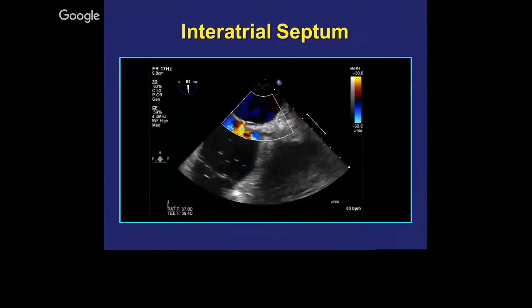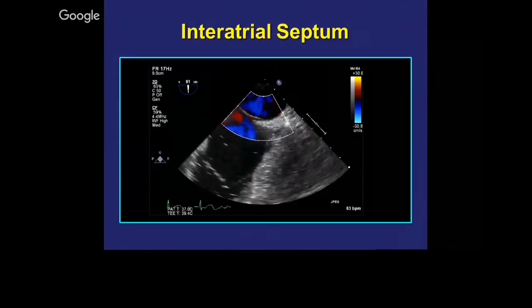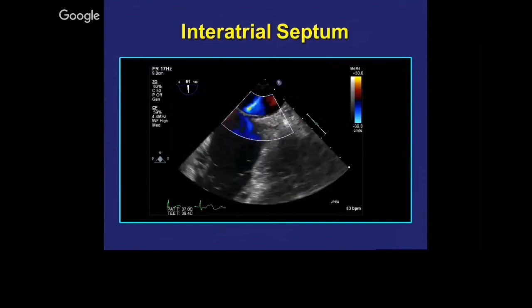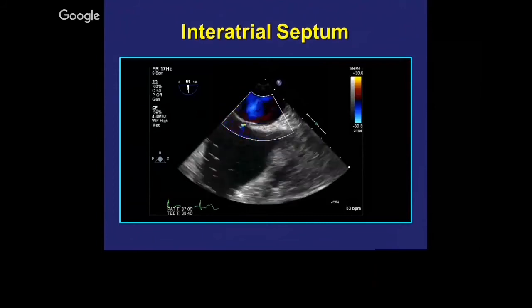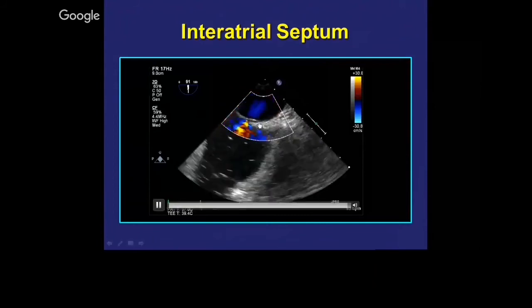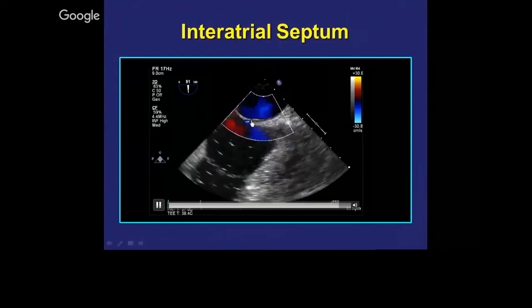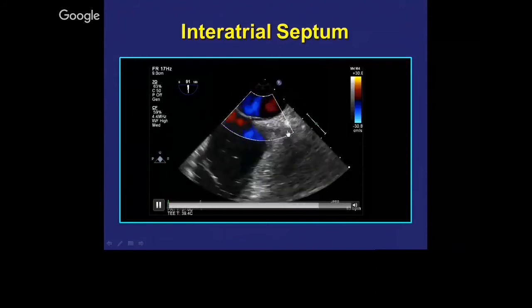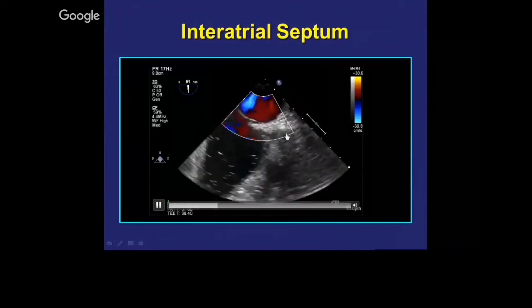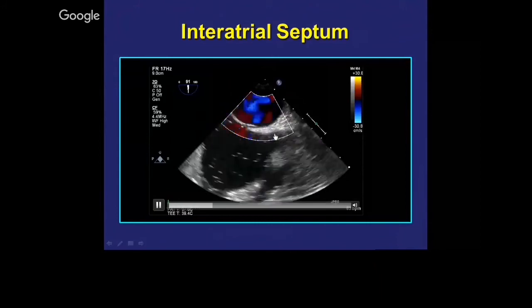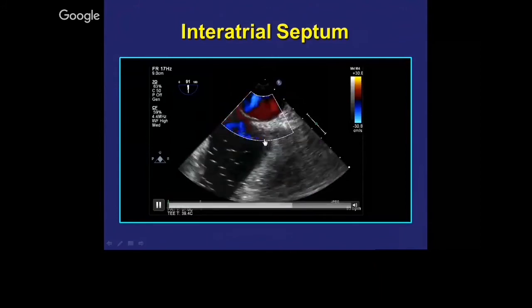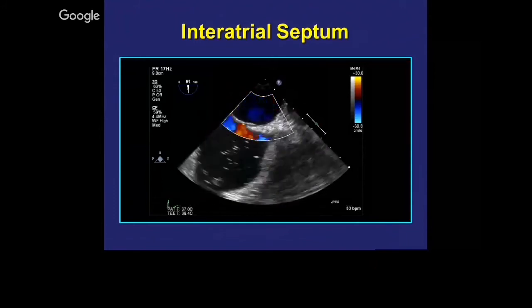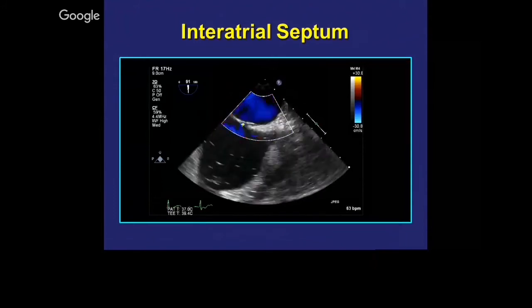A bubble study is the most sensitive way to find a PFO, but a negative bubble study doesn't necessarily rule it out. What you can see here looks like a tunnel PFO giving a left-to-right shunt. This bicaval view shows the IVC to your left and the SVC to the right. This view is also important when dealing with ASD, especially when looking for other types of ASD apart from the secundum ASD.